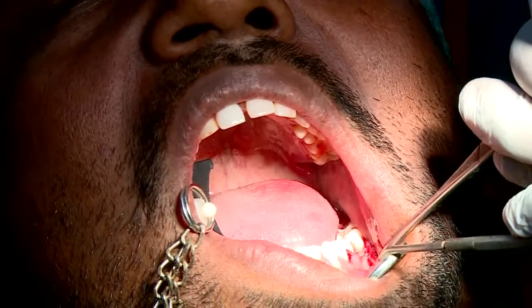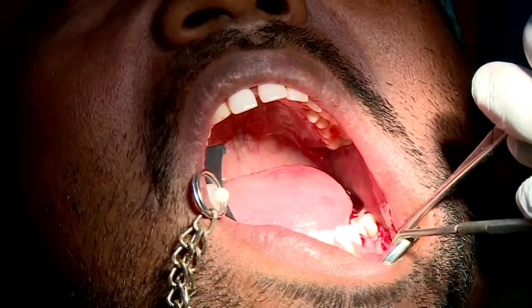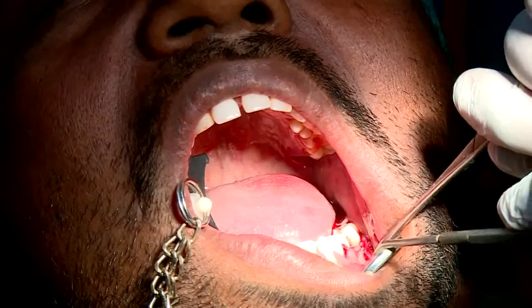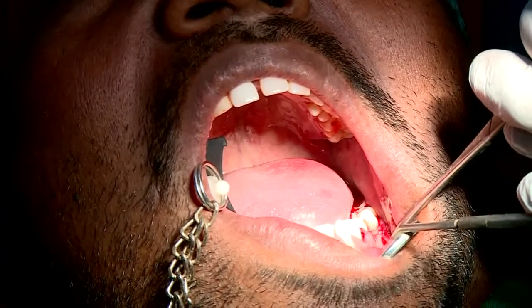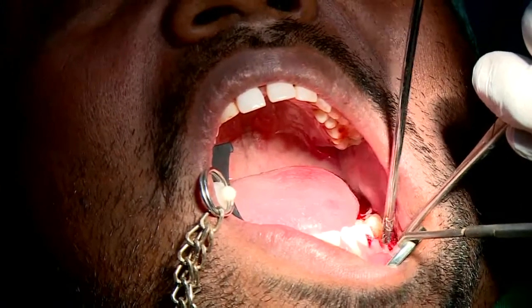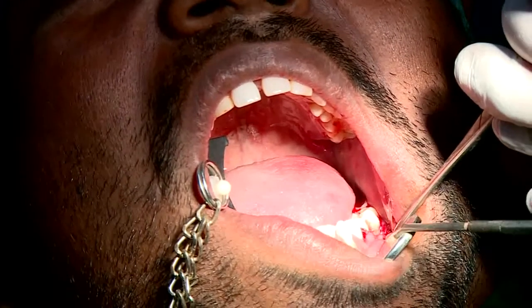Leave it for 3 months for a mandible and between 4 and 6 months for a maxilla. This becomes part of the bone. In other words, it undergoes what we call osseointegration. In the second stage, Dr. JK will explain what we do. We take out the cover screw and then place another attachment, and then we can go in for a crown. There are a lot of different ways of doing it, but that's pretty much it.